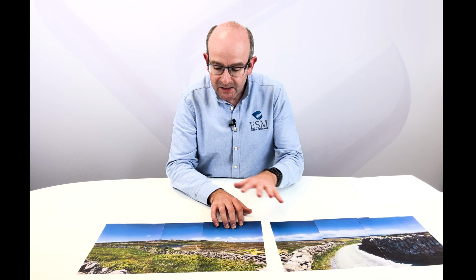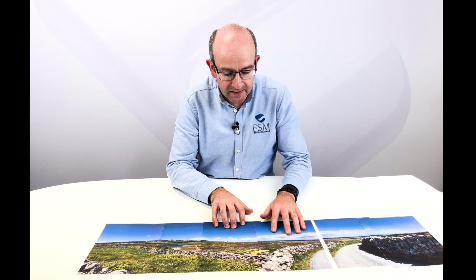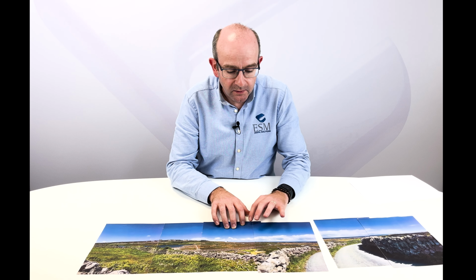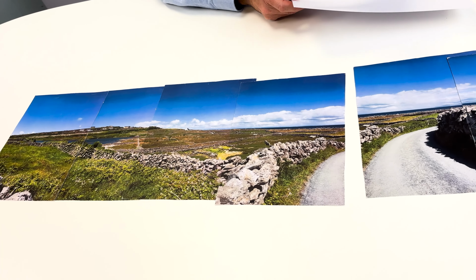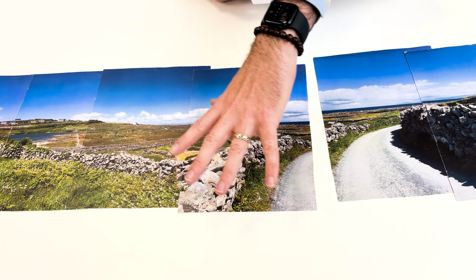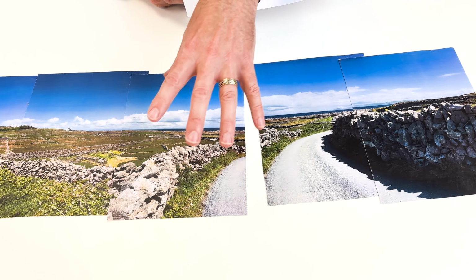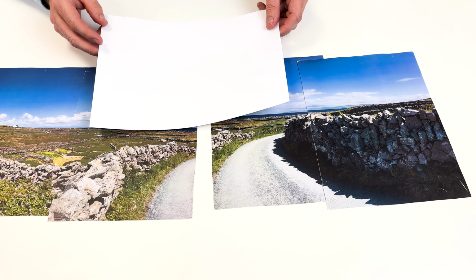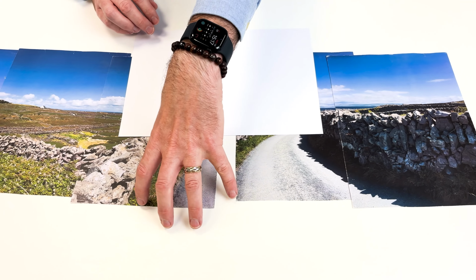So let's continue on. We're just keeping these ones as they are. So now I'm looking at a situation again, and I line this one up, and everything is looking good. Now I'm going to try and simulate something, so we're picture, stitch, stitch, all going together. Maybe we drift off course. So we've drifted off the arch, we've drifted onto finger, onto lip, onto cheek, onto gum, onto tongue, whatever. We've maybe drifted off, so we're not seeing as much information. So now this is the information we're seeing.